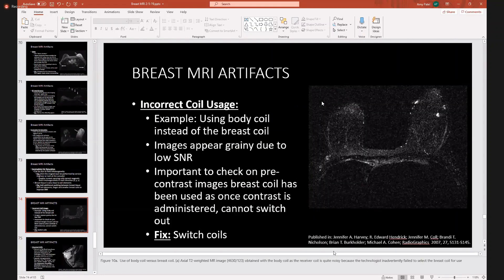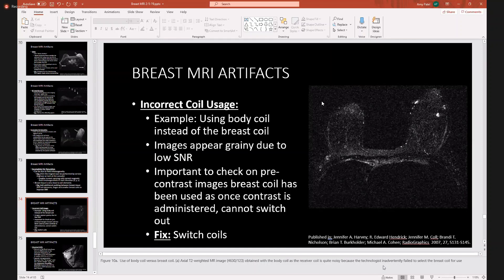Incorrect coil usage — you might think this is silly, but this can happen where a body coil is used instead of a breast coil, and your images look really grainy because of low signal-to-noise ratio. Obviously, the way you fix this is to make sure you're using the right coil, and make sure you're using the right coil before you inject contrast. That is incredibly important.